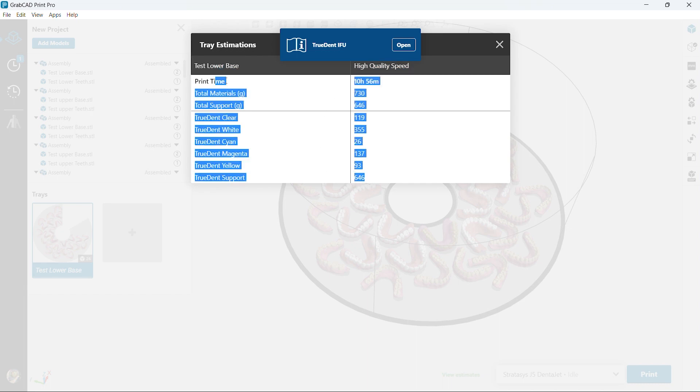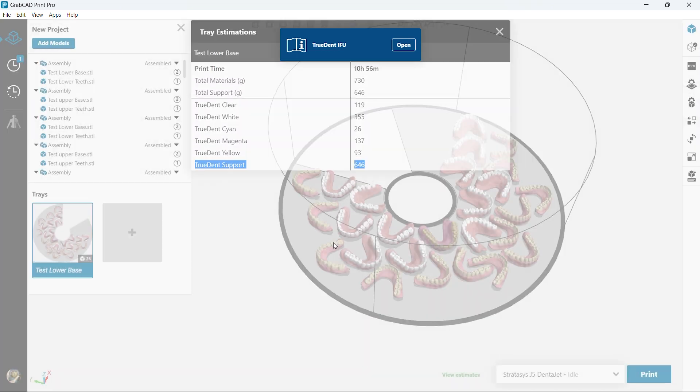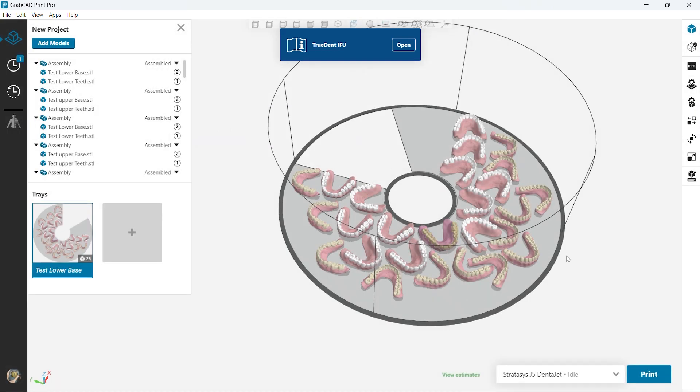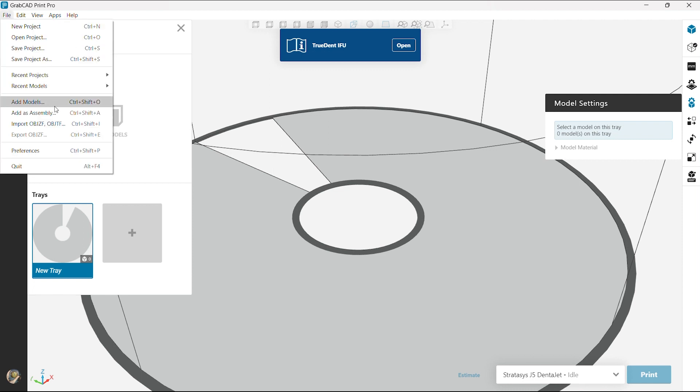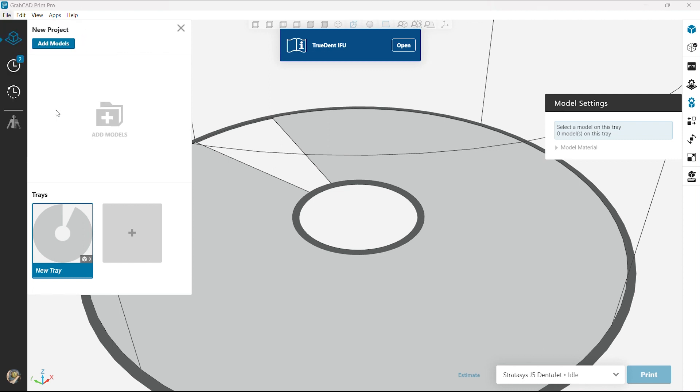And the beauty of the software is we get as complicated as we want. With 3D printing, complexity is free.